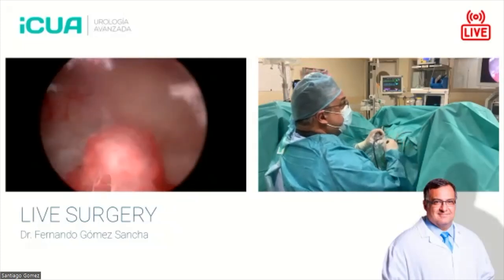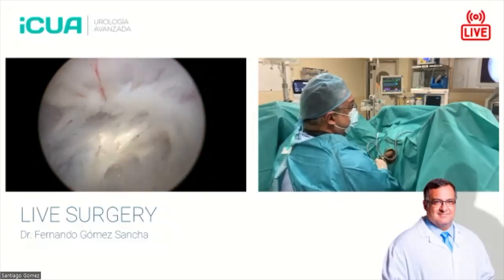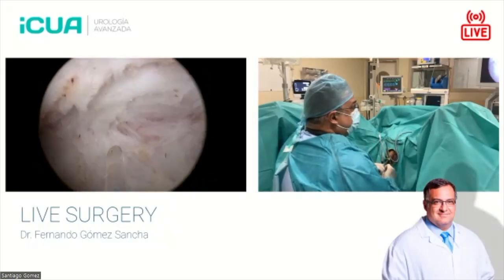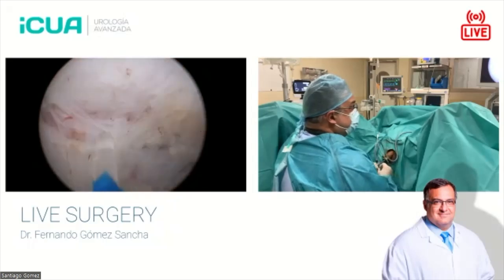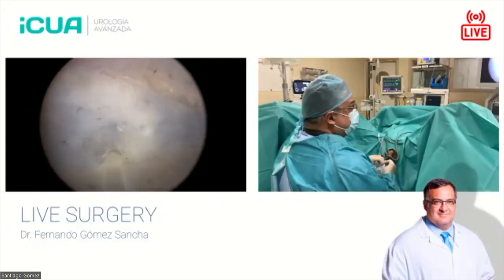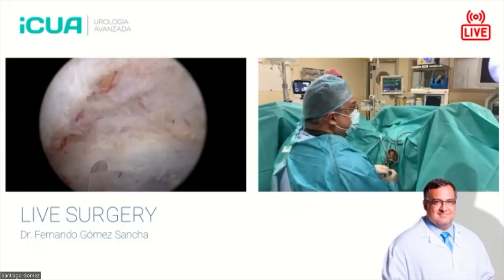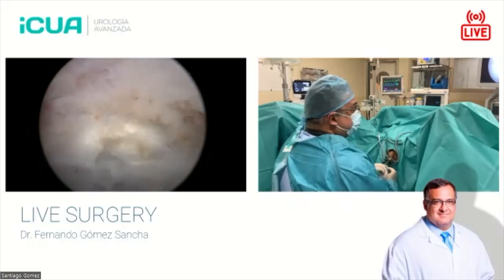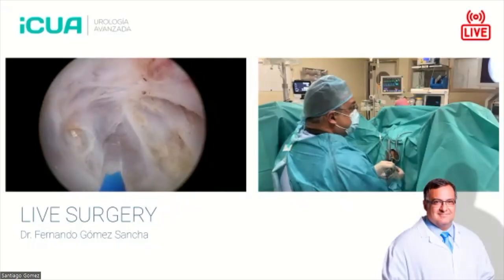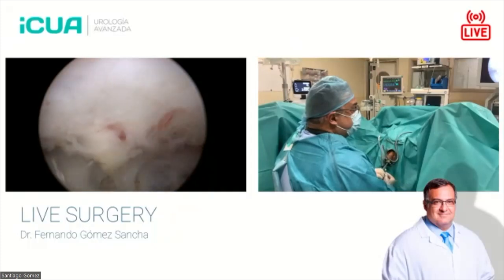Okay, so I did a little bit of posterior dissection here. The fourth factor, and I think it's one of the most important factors, is where you fire the laser relative to the line of dissection. You can see this is my line. I could fire against the line like this. I could fire outside of the line, so against the capsule, which is usually a bad idea. And I could fire closer to the adenoma. This is what I call the aiming, and aiming is paramount, because here, for example, there's some depth in the capsule, so I have to aim a little bit closer to the adenoma to correct.